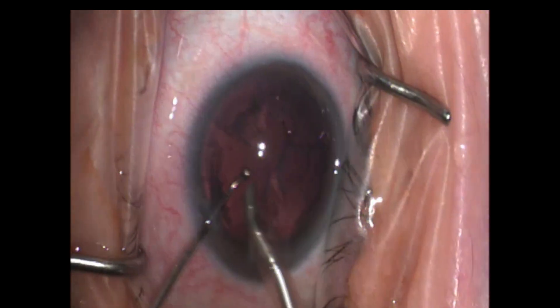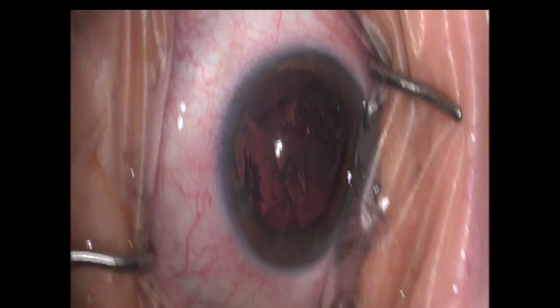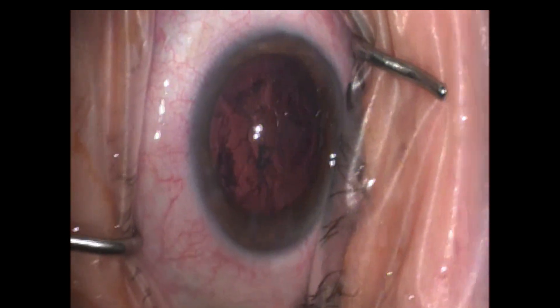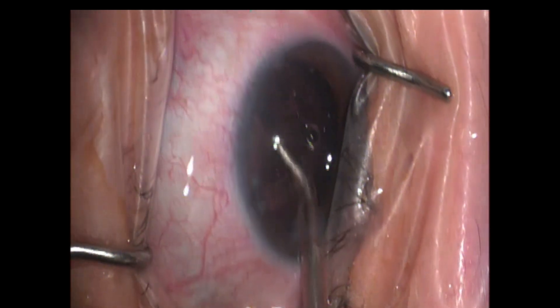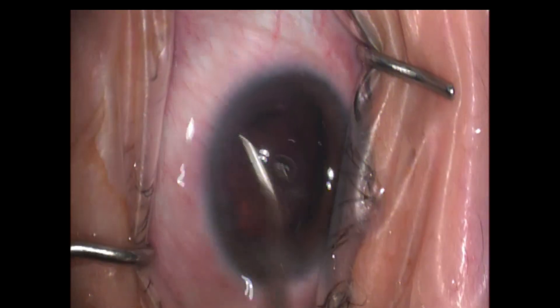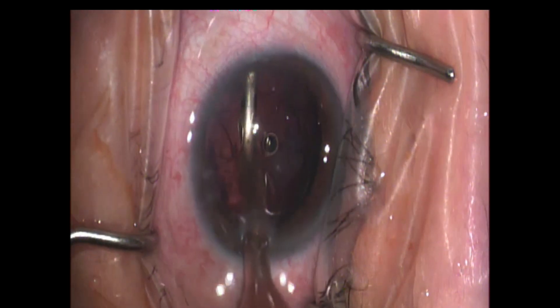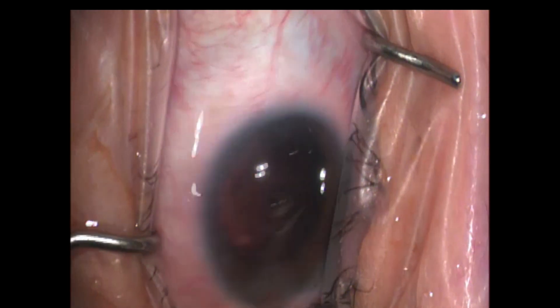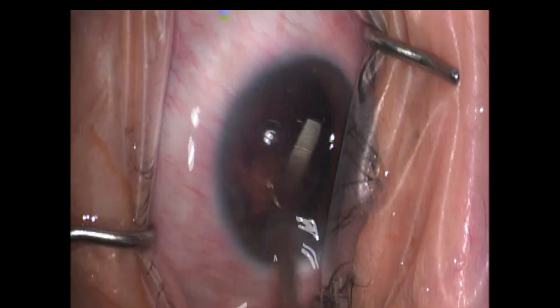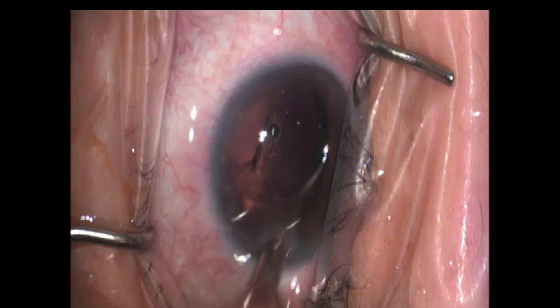Once it is fully out, we're going to come back out. Now we're going to go back in to remove the residual cortical material. I use a metallic tip here. The goal is just giving a light amount of pressure — a 'walking the dog' strategy — kind of leading that capsule around, loosening it everywhere, and allowing the sections that want to come freely to come freely. The areas that don't want to come freely, I always come back to after removing the rest of the cortex, which loosens everything up and makes it relatively easy.